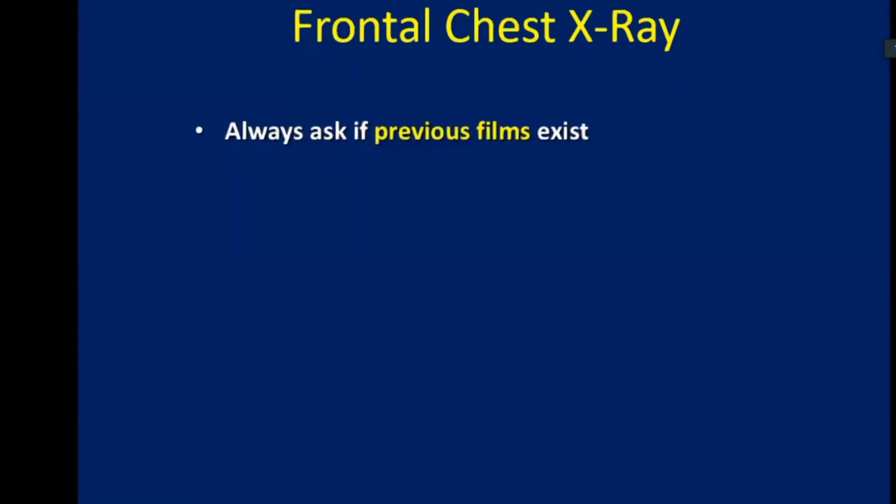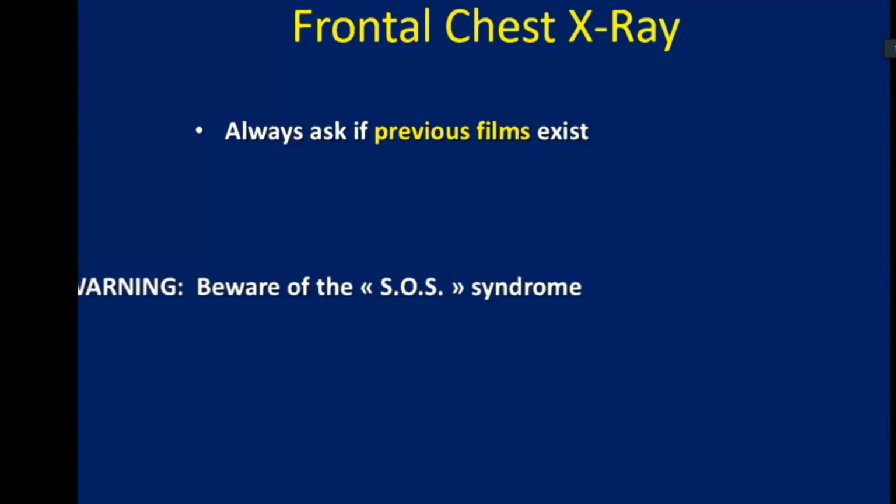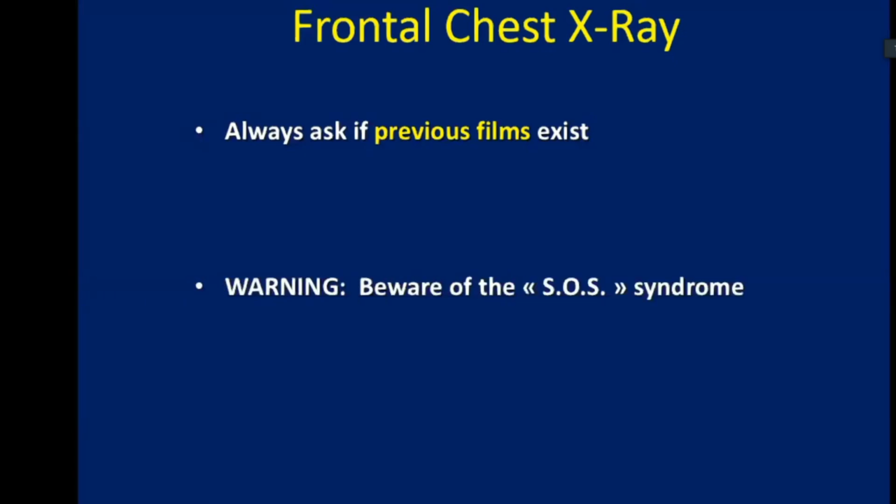So always ask if previous films exist. So our best friend is the old radiographs. And remember to beware of the SOS syndrome, which is the satisfaction of search, or the happy eyes syndrome.